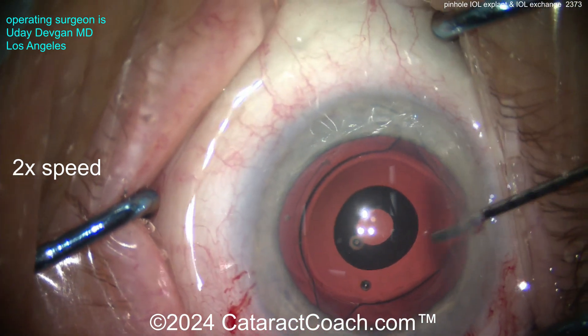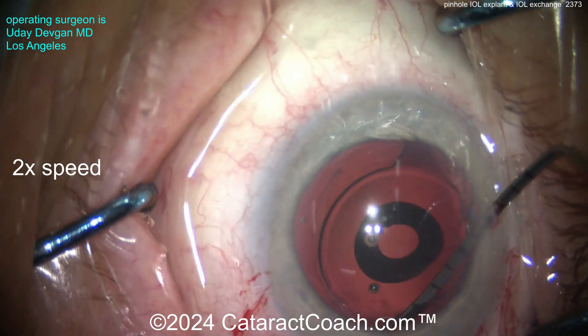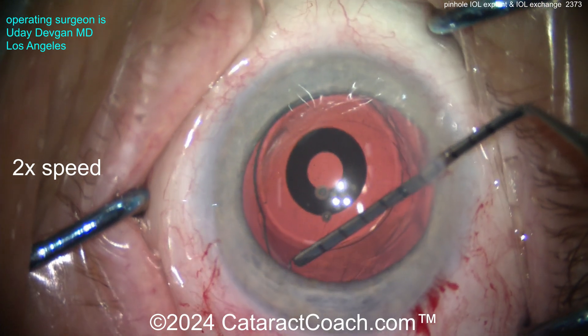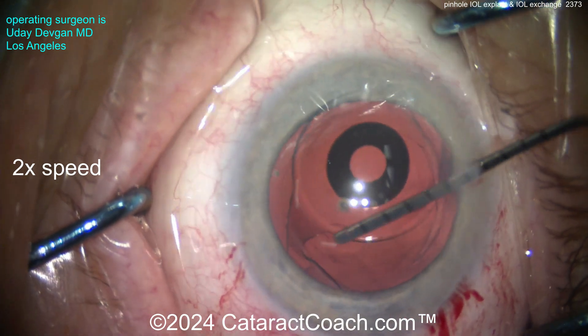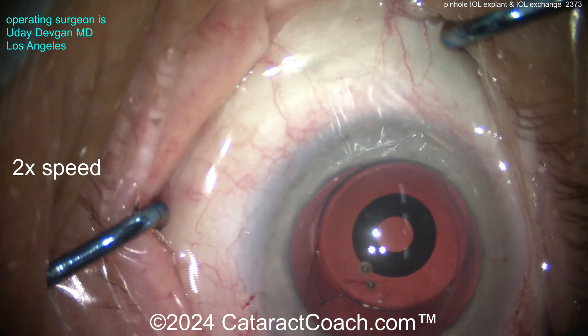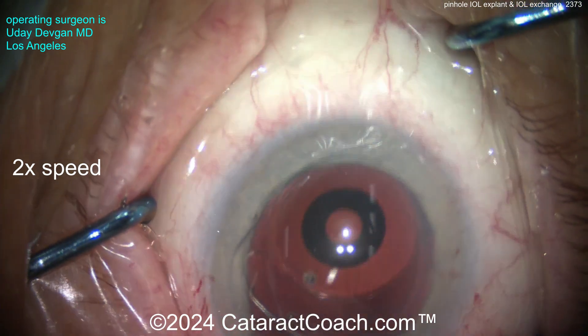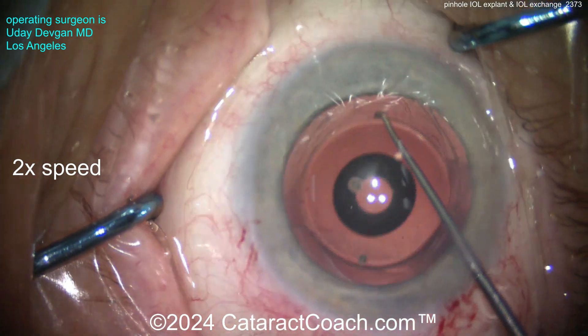That pinhole effect — the round black ring — is within the IOL, and it adds an extra layer of thickness, making it a little tougher. Using a spatula to gently dissect the capsule open, and then once we get that haptic freed up, we can bring that up as well.